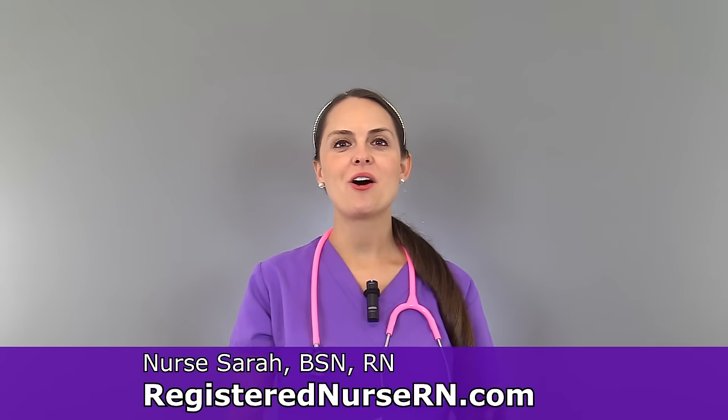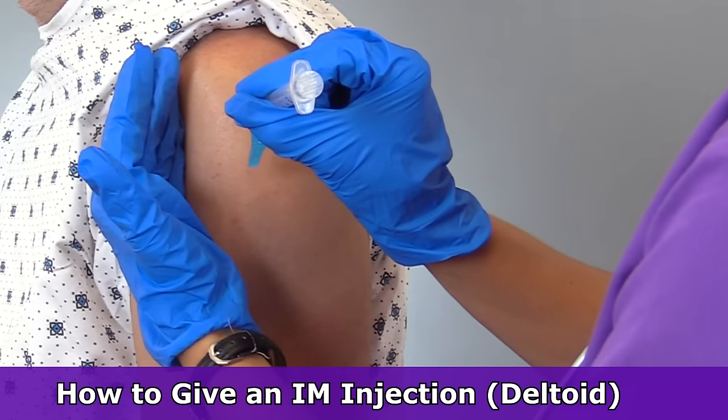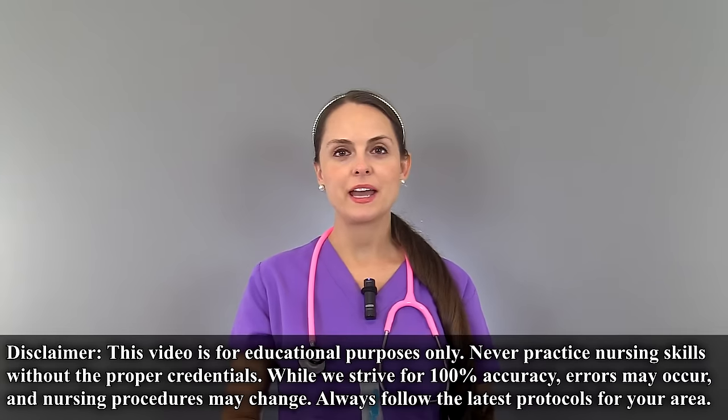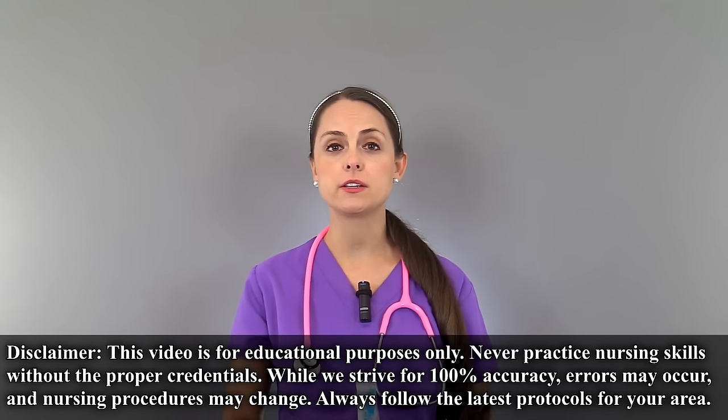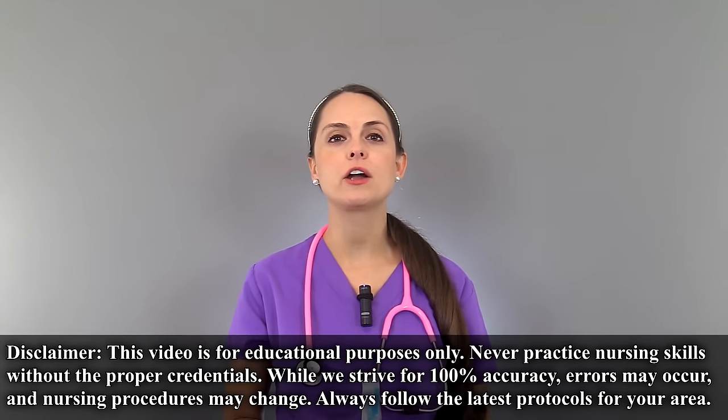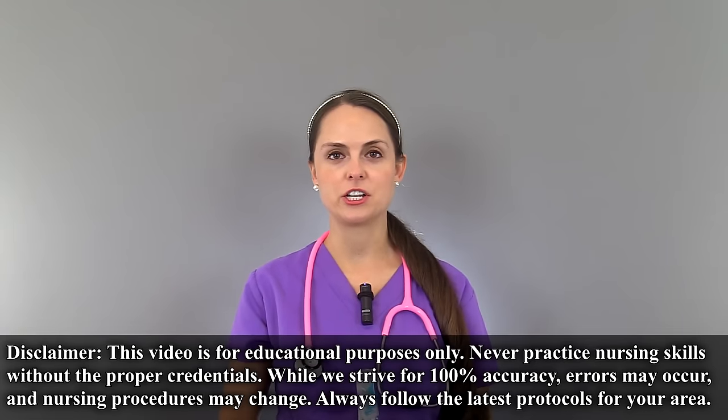This is Sarah with RegisterNurseRN.com and in this video I'm going to demonstrate how to give an intramuscular injection in the deltoid. Before ever administering any type of medication, including IM injections, you always want to review your facility's protocol and how they require you to administer that certain medication.